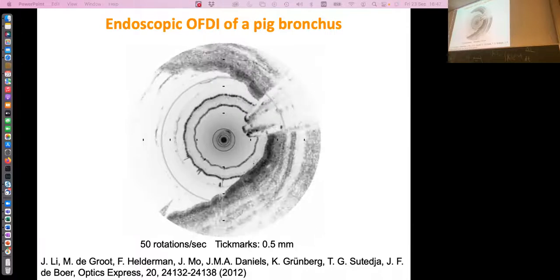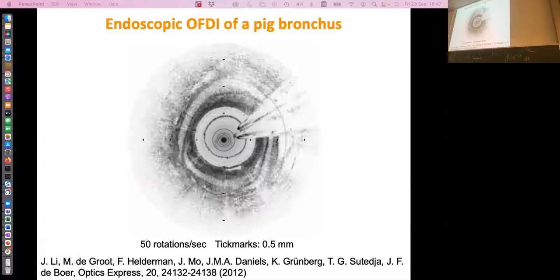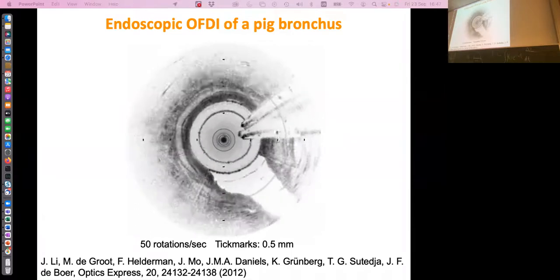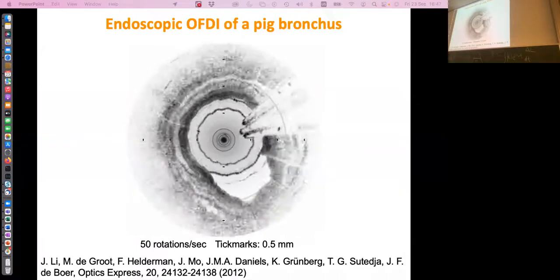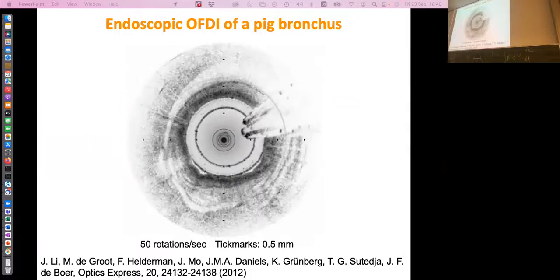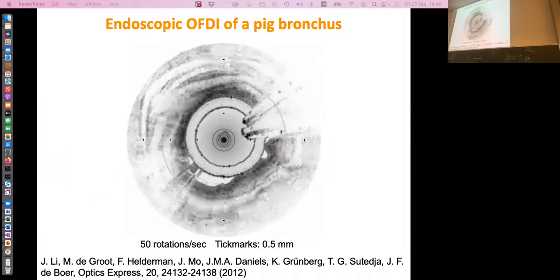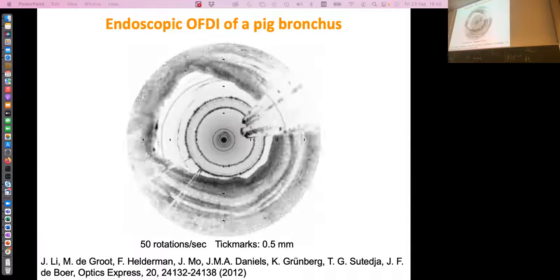It's a hypothetical question. If you can attach a radio tracer to it, you think you can also attach a fluorophore? Yes, that's an important question. Yes. So with the molecular sensitivity of PET, you can also do the optical side. You can take a monoclonal, take a fluorophore, and then you have molecular sensitivity.